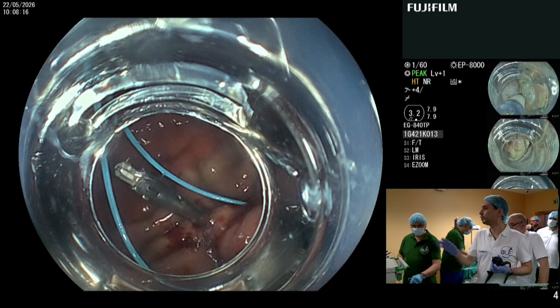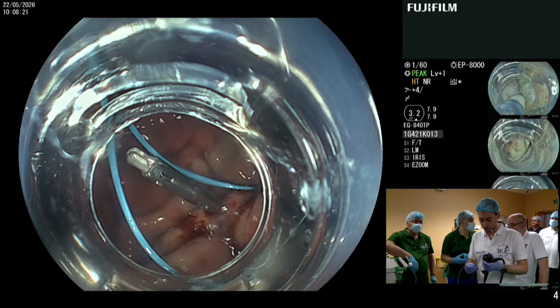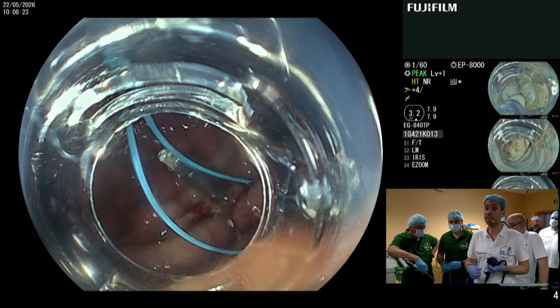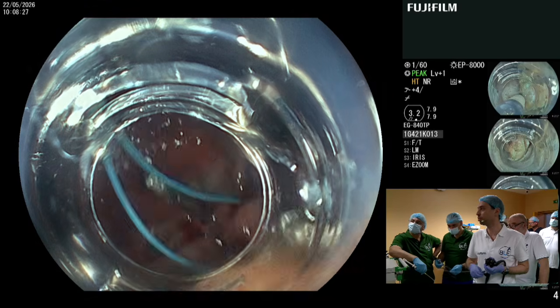This is the way I close the defects after G-POEM. This is what I usually do in case of mucosal injury of the cardia, because in POEM, if you do injury of the cardia, it's not always easy to place clips.